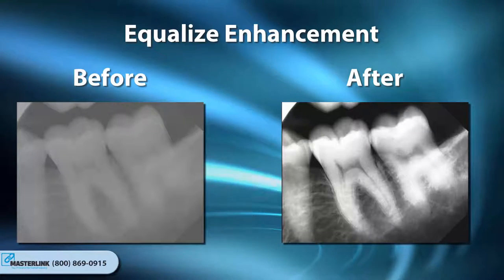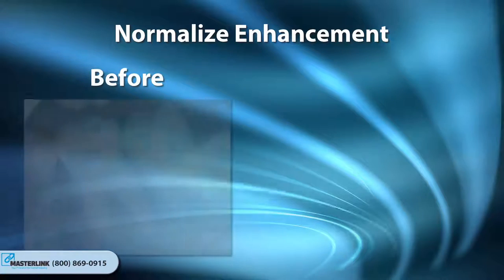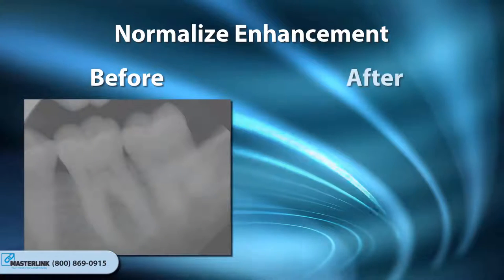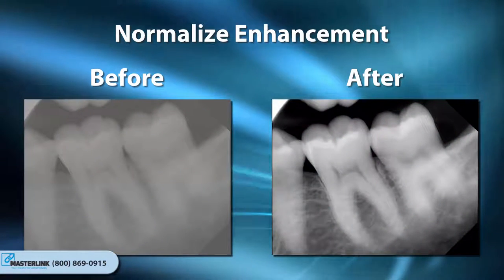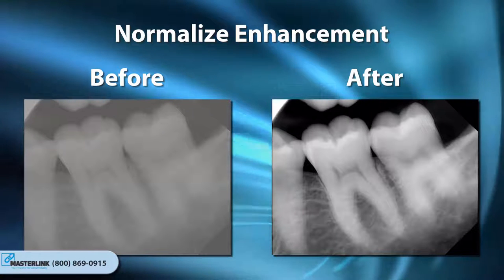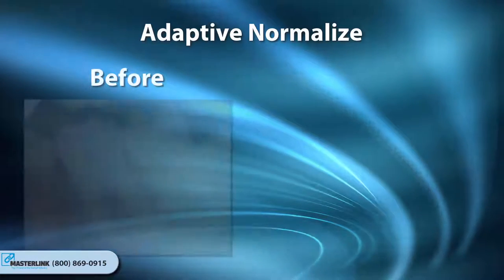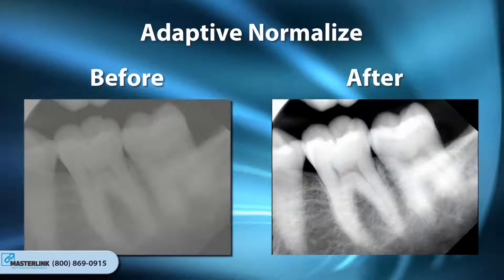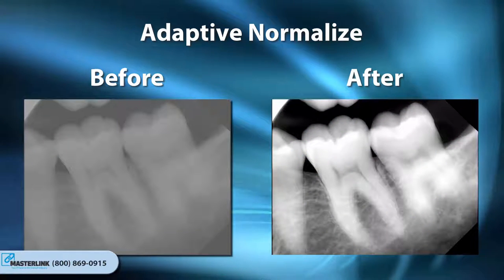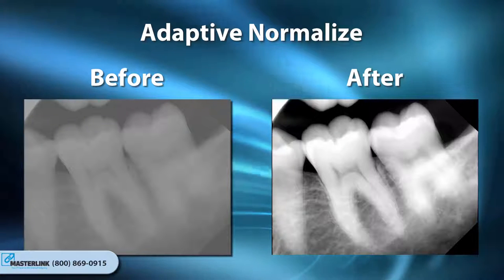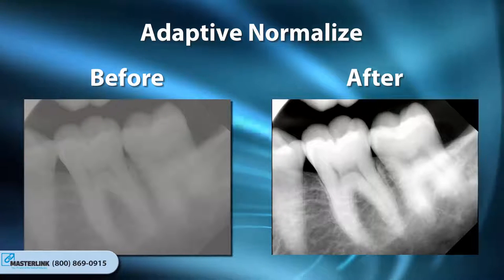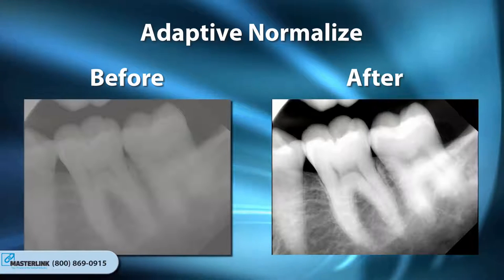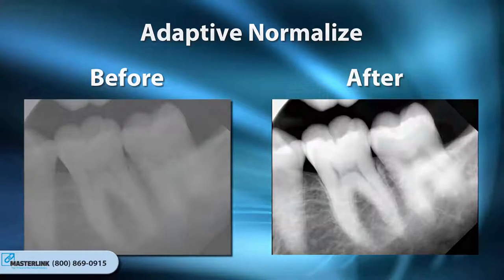The Equalize option is only available for grayscale images. The Normalize Enhancement increases the contrast in an image by stretching the range of image intensities to cover the entire range of intensity values. The Normalize option is only available for grayscale images. The Adaptive Normalize operation usually results in the best brightness contrast for an image, using adaptive algorithms to determine the best application of the Normalize algorithm. When adjusting brightness contrast, Adaptive Normalize is the recommended first attempt.